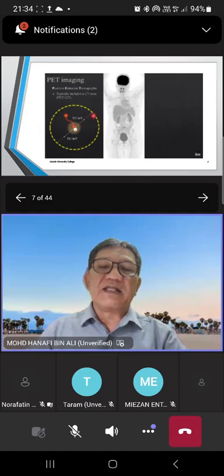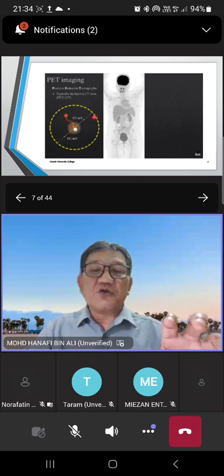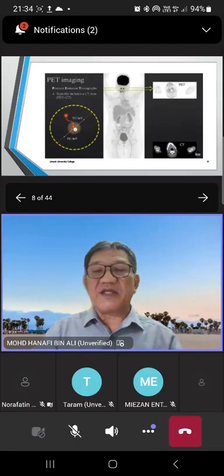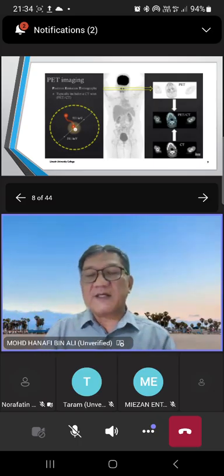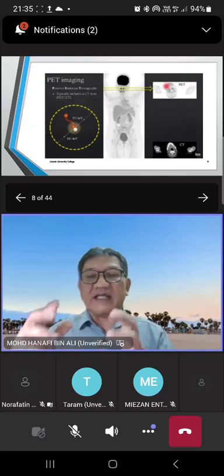This is a PET CT. Yeah? The image is something like black dots only. That's why it's not nice and hard to see the area. That's why they combine it with a CT scan so that we can get a better image like that. Okay, here is the PET image, here is the CT image. They combine together. You see, you can see the very nice CT scan of the face here, the mandible and head over there, and we can see that it is the same area, the same level. Then combined with that, we can see two images very nicely combined, then they can detect.